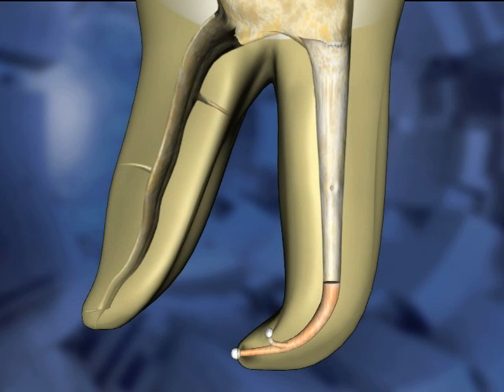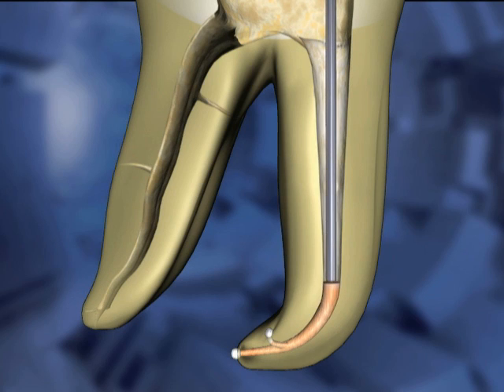Upon completion of the down pack of the canal, the backfill can be accomplished coronally up to the pulp chamber or to a shorter point if a post is prescribed. With the Calamus device loaded and hot, insert the needle into the canal space down to the previously packed filling material.